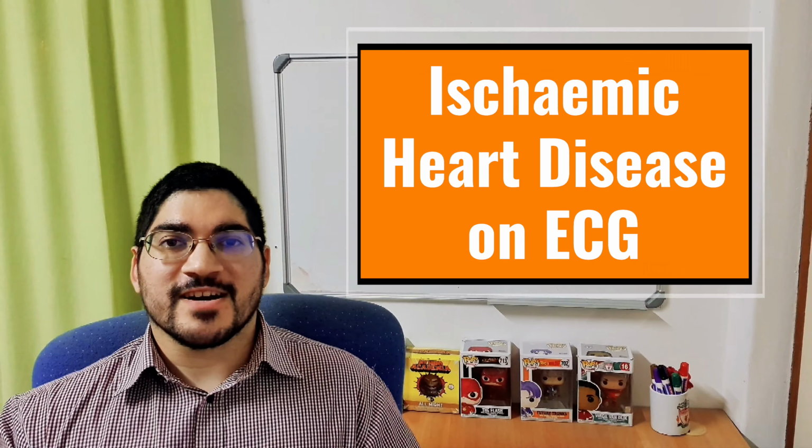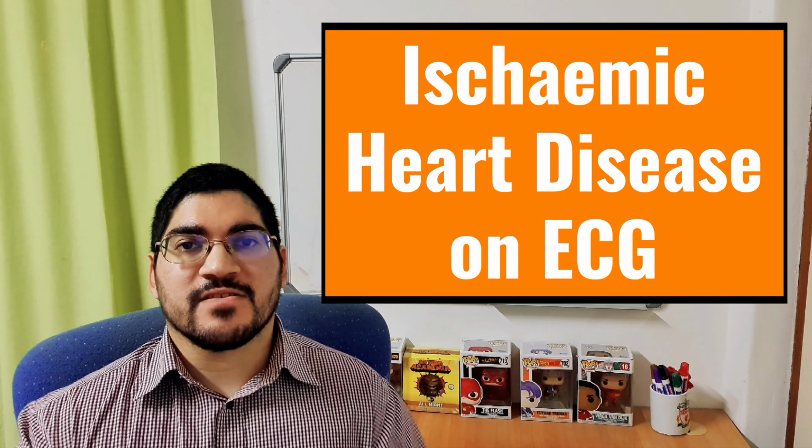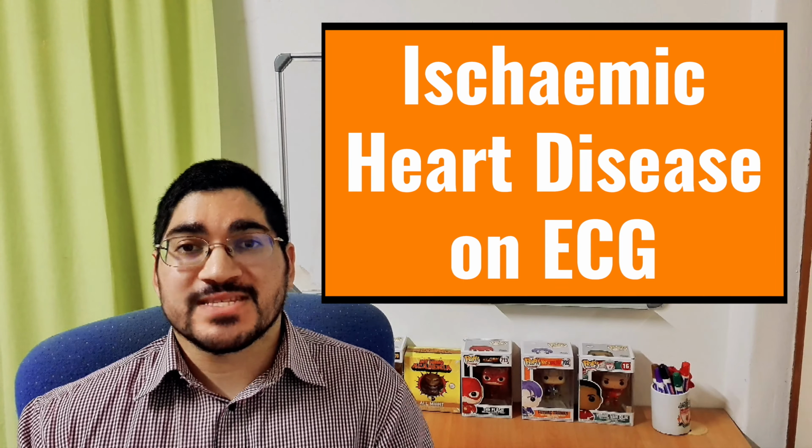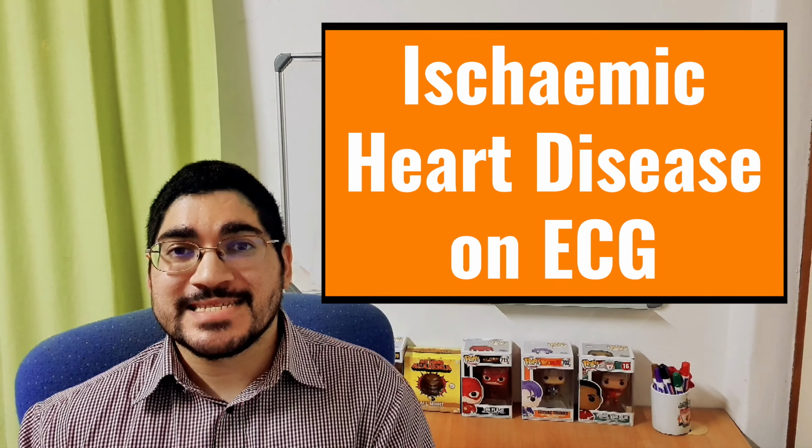Hey everyone, welcome back. Today we're talking about the ST segment of the ECG and its relation to ischemic heart disease. Now, if you've ever used an ECG to diagnose ischemic heart disease, the ST segment is the segment you're going to want to look at the most. So let's get right into it. Why is it important?